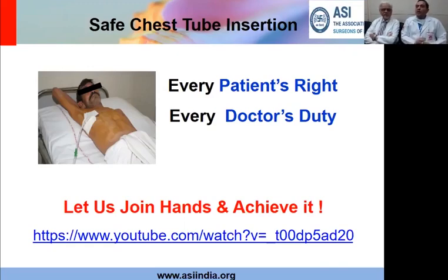Please do not flush a chest tube. There is no role of flushing because you will 100% introduce infection from outside into the chest cavity, and you may not even end up opening the chest.